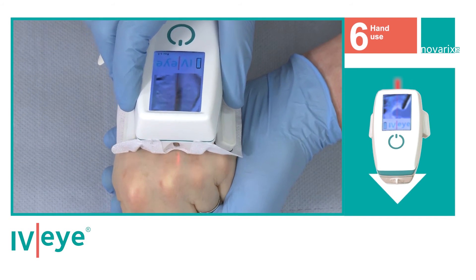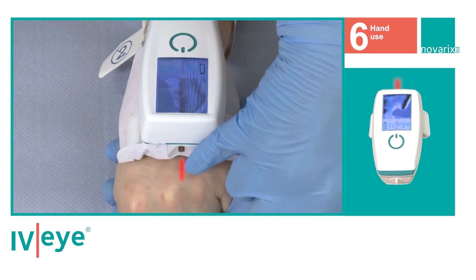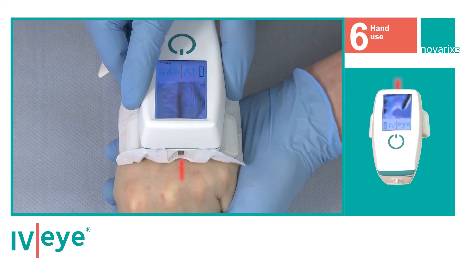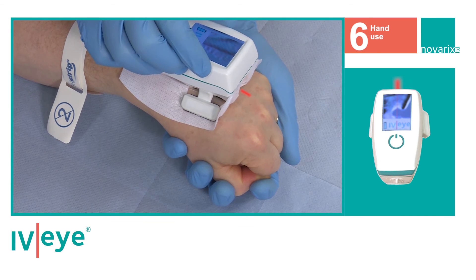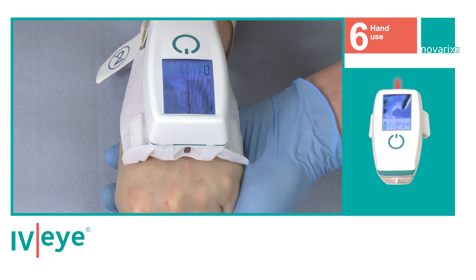Move the device back slightly and mark the vein position as indicated by the red index light in front of the device, through either visualisation and memory, the use of a derma pen, or through capillary compression.